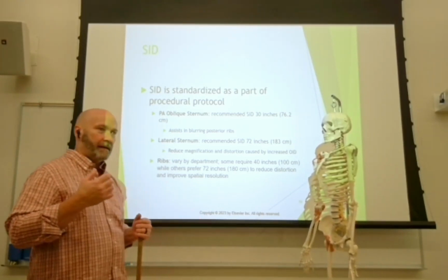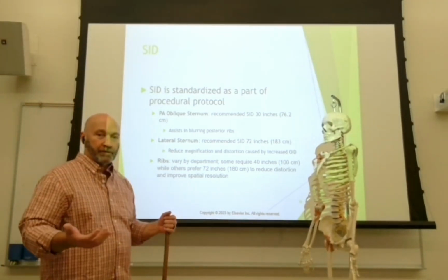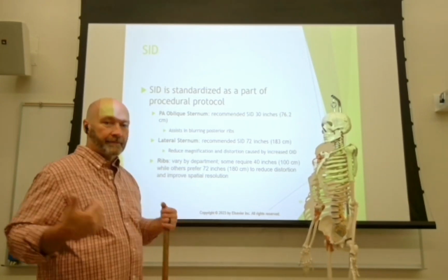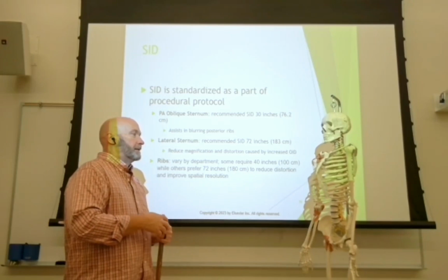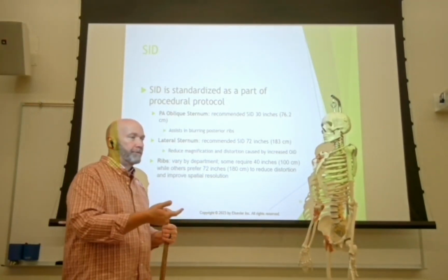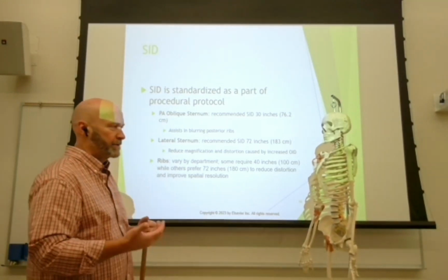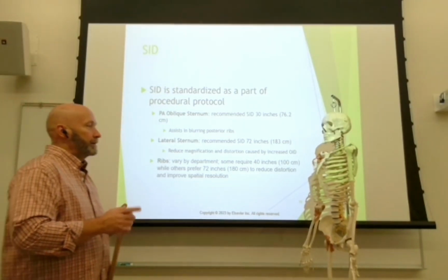So even in best case scenarios, we're going to have a tremendous amount of soft tissue on it. Patient's back, their anterior chest wall may have the heart on it, which we prefer to have the heart on it. We're going to have lungs on it, and then we've got the ribs going across it. So it's very difficult to image.